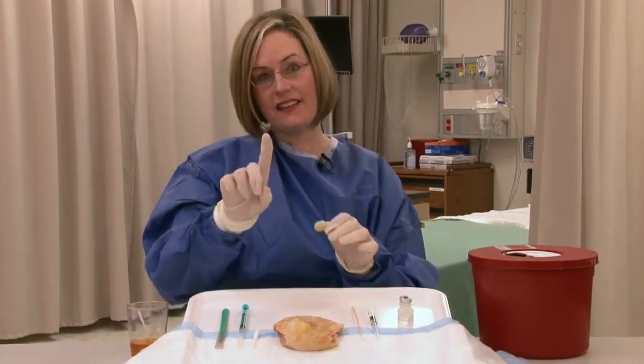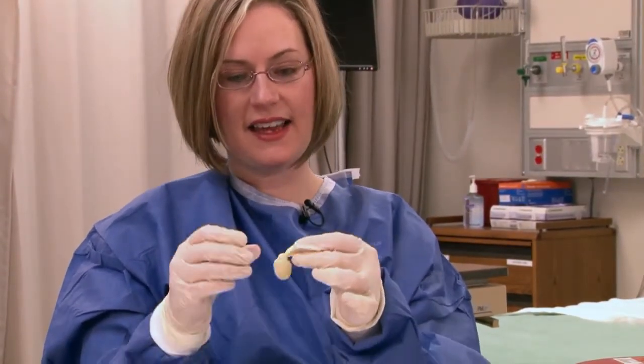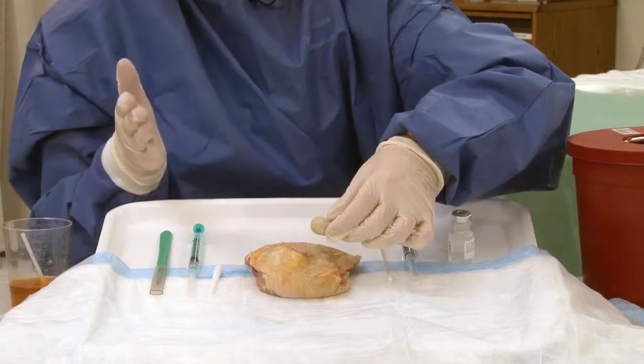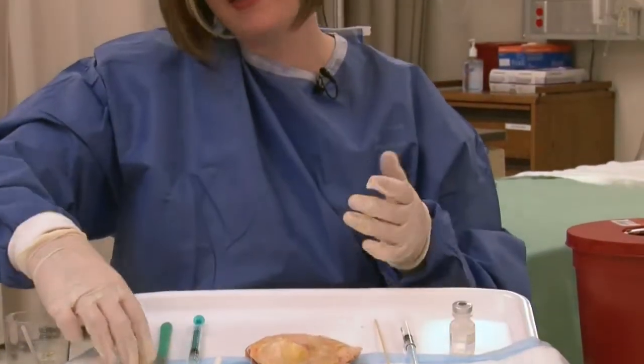Taking the end of a clean glove, oatmeal and water were mixed and placed inside, and the area was secured off and then cut. That was then placed under the first layer of a chicken thigh. Any chicken wing, chicken breast, chicken leg, anything could be used. In addition, calf liver can also be used.